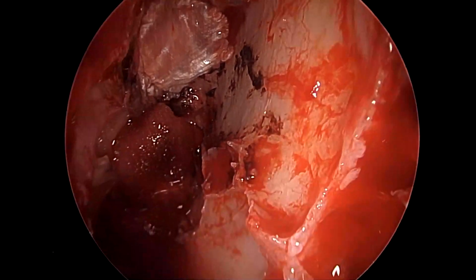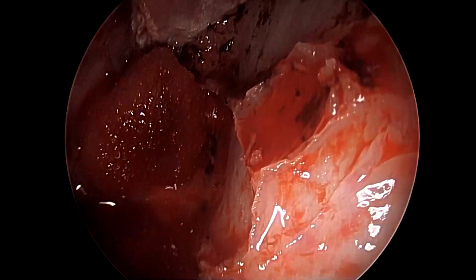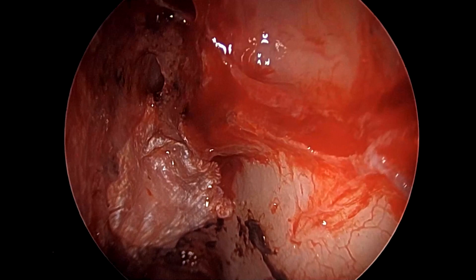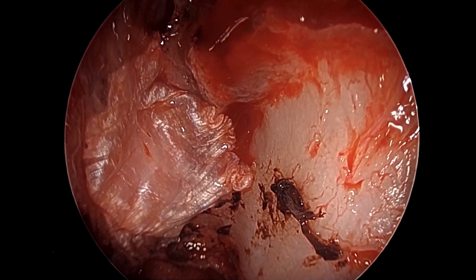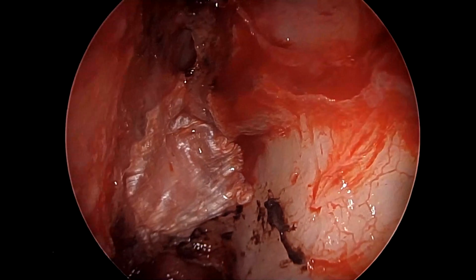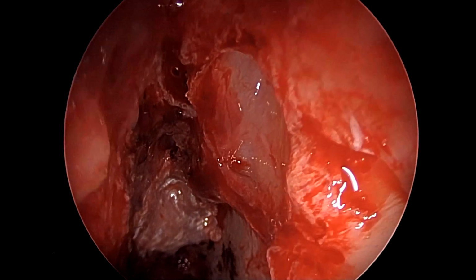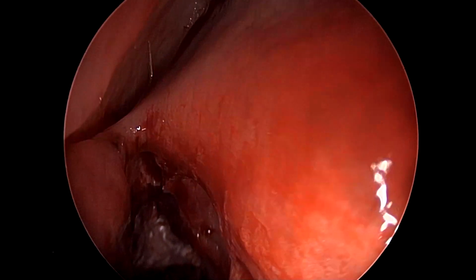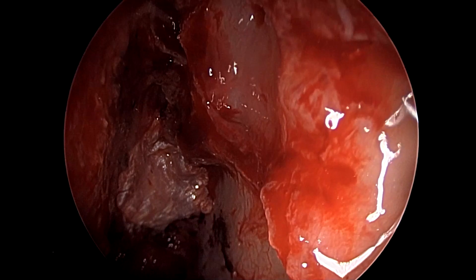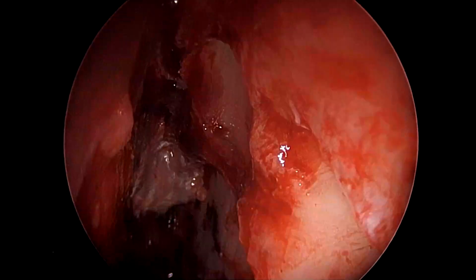Now, once this has been done and tissue glue has been used, we could just cover this assembly with either Surgicel or gel foam. If we had not used tissue glue, we could have used Surgicel for better adherence to the bone. But here, since we have used a tissue glue, we would straightforwardly proceed to placement of gel foam layers on this graft material to give support, as gel foam absorbs much more than its own weight in water and saline, and helps in eventual adherence of this graft to the bone.